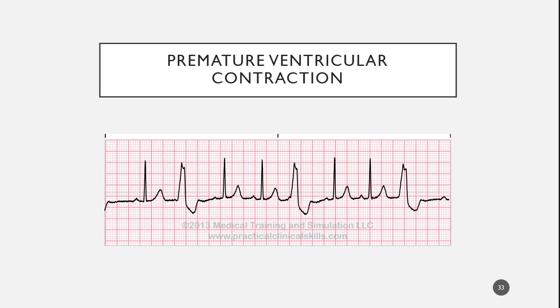So I think what we would write on a test for this, you would say normal sinus rhythm with unifocal trigeminy. Is that how you would say that? Yes, unifocal ventricular trigeminy, because it is possible that you can have trigeminy both with PACs and with PJCs. It's not common. You will see this happening within the ventricles much more often than you will at the PAC or the PJC level.